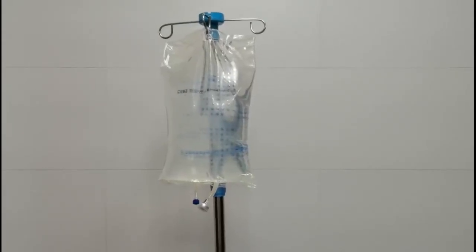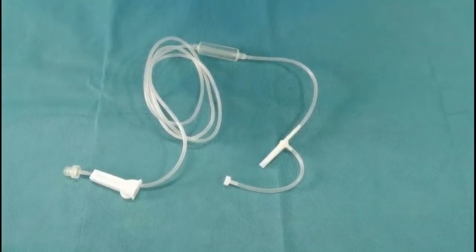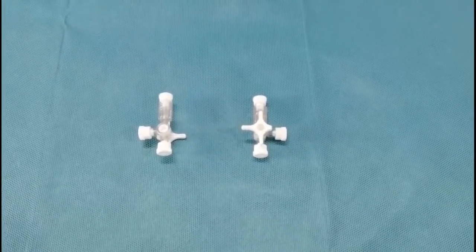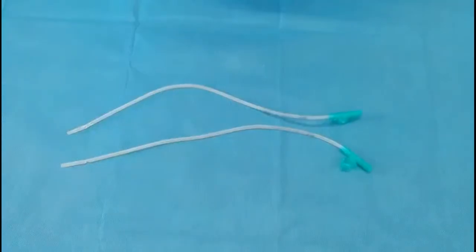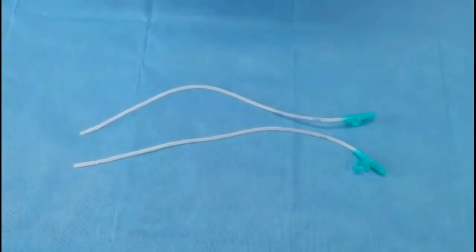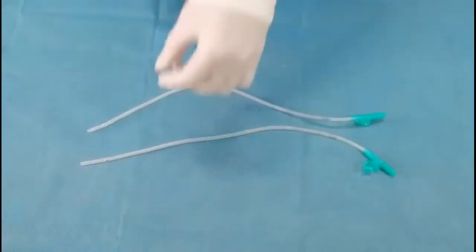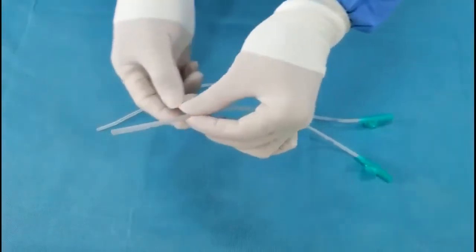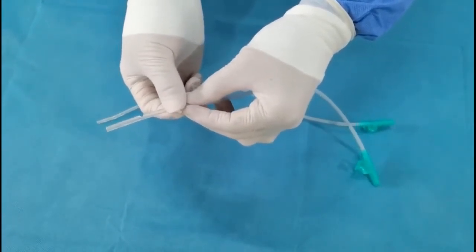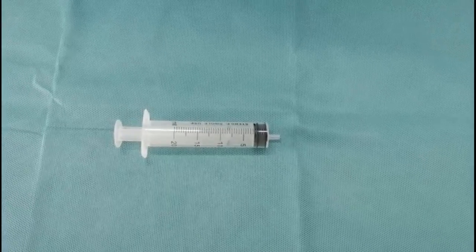Equipment required: sodium chloride irrigation solution in a three-liter bag, infusion set (no intravenous needle required), two three-way stopcocks — one connected to the inflow tube and the other to the outflow tube — two sputum aspirating tubes, one for the inflow tube and one for the outflow tube. Several side holes are cut at intervals of half a centimeter; the exact number depends on the size of the joint cavity. The piston of the T-shaped tube of both sputum aspirating tubes is closed to form a closed cavity. Additional items: urine drainage bag and a sterile 20-milliliter syringe.